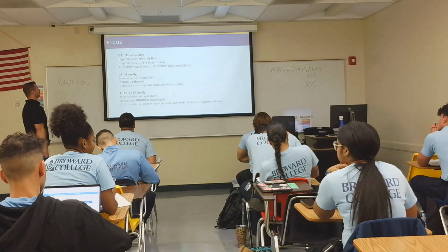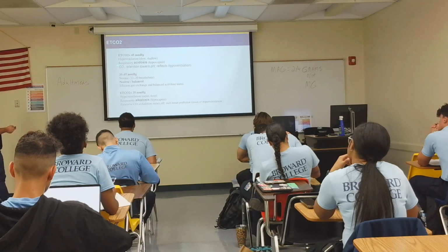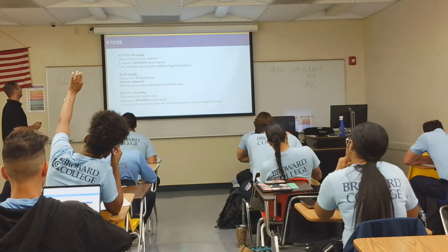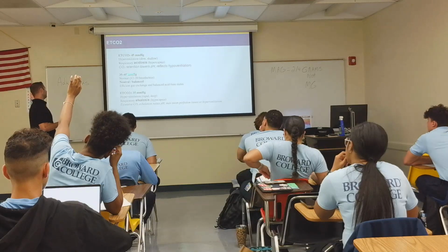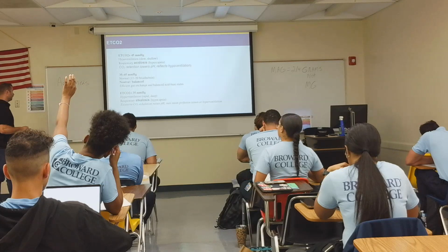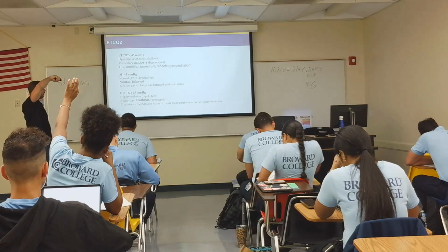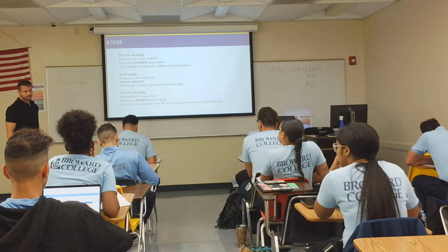So we've got to understand that. My end tidal is above 45, I'm breathing slow, my respiratory acidosis is occurring, that means my pH is low as well. pH low, hypoventilation, high end tidal CO2 number. That's my normal. Then this is the opposite, hyperventilation. If I'm breathing fast, my breathing rate is high, my pH number is also high, and this is going to be low.